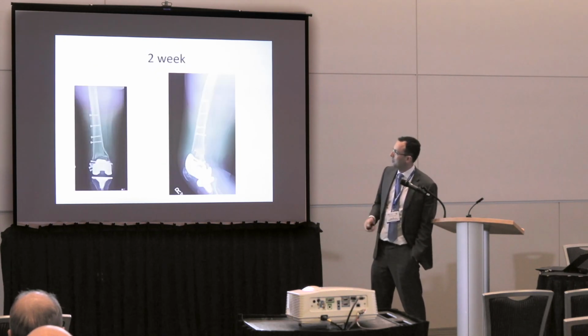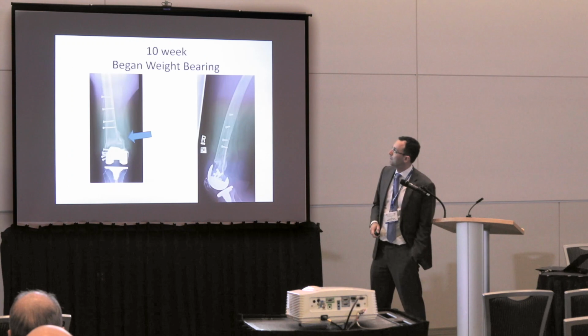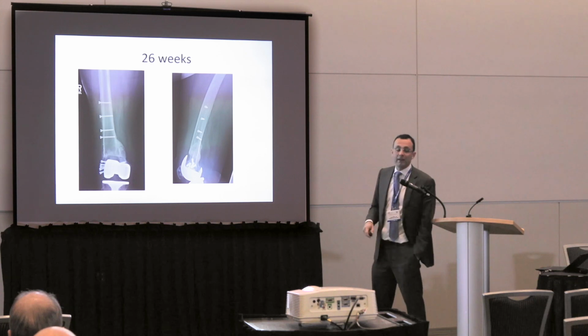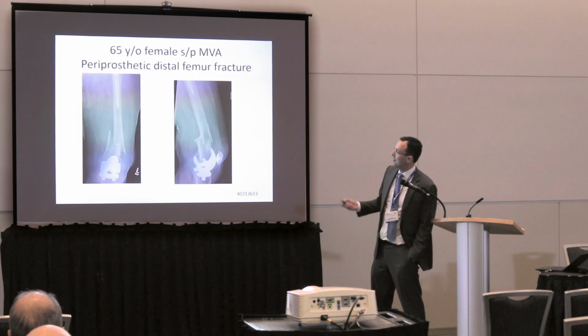66-year-old periprosthetic, 2 weeks out, 6 weeks out, again, there's that medial callus that we're mentioning. 10 weeks, she began weight bearing. I probably could have started at 6, so it was maybe a little chicken. That's probably my typical MO for all aspects of my life, just so I say. 26 weeks, and she's doing great, and that was the last follow-up on her.